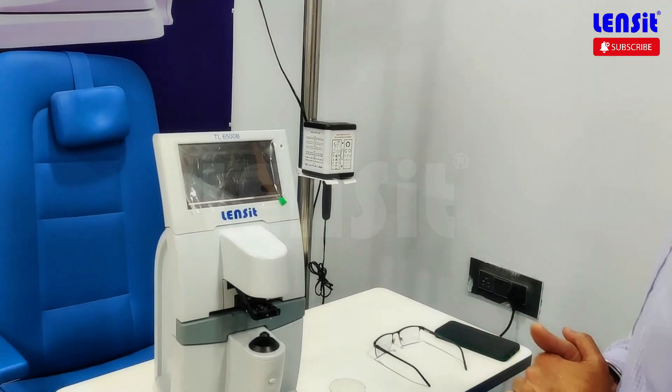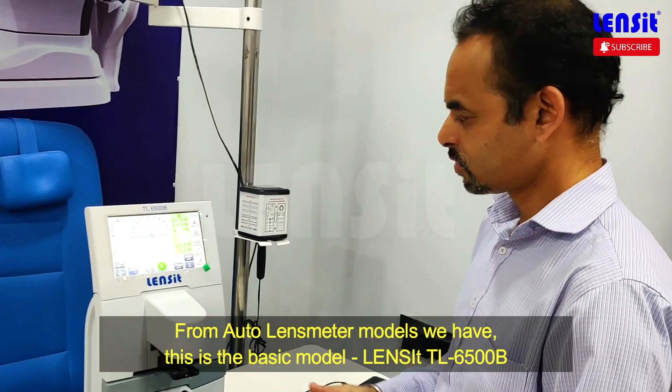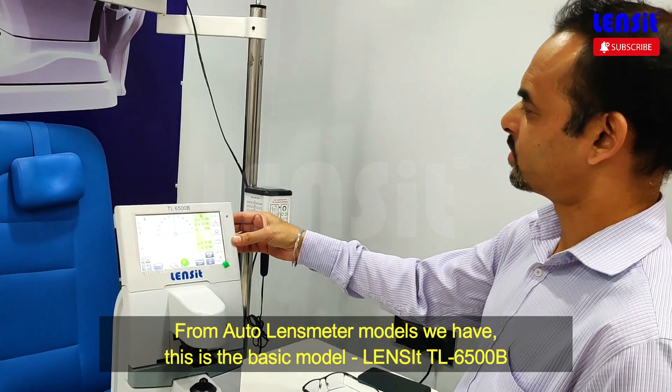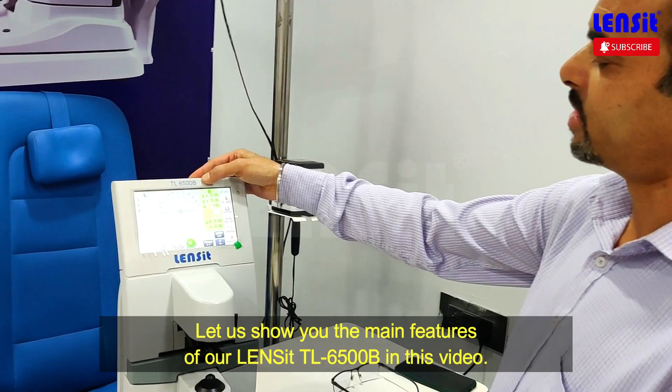This is a basic model, the TL-6500B. These are our 3 models — I want to tell you about the basic model. This is the TL-6500B.